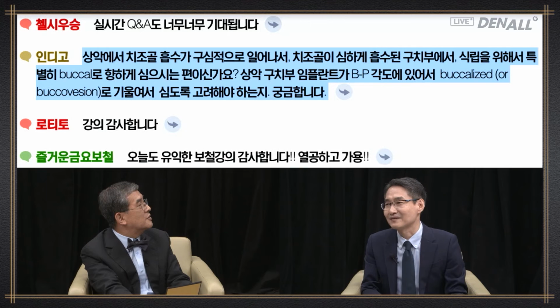It should come out approximately at the middle of the CEJ. So most of the screw holes will come out on the buccal side, and therefore, screw-retained prosthesis is basically impossible. You'd have to do cementation in most cases. It's very unfavorable in many ways.